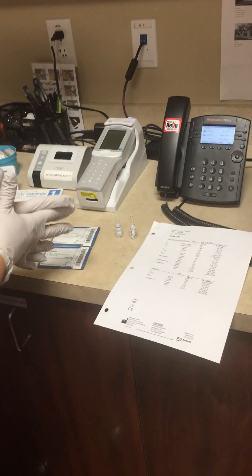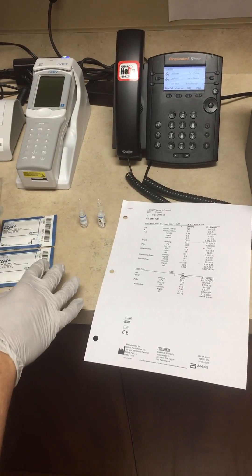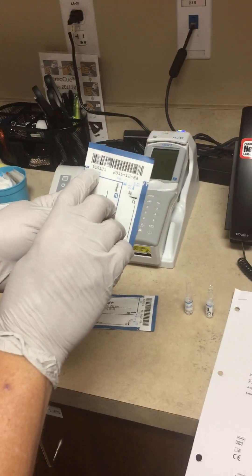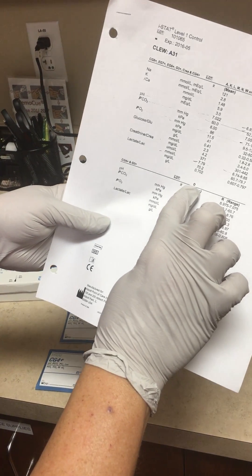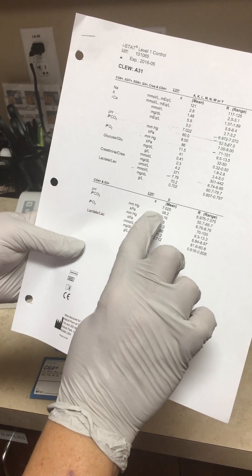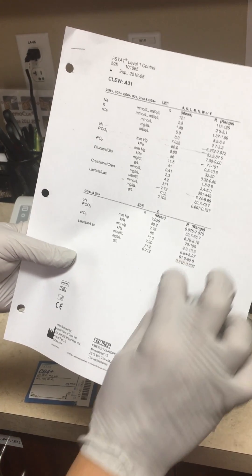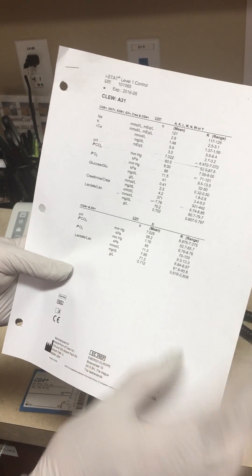We've got the correct lot number of the reference ranges for the controls that we're using. One thing to pay attention to is the lot number of your cartridge — it starts with a D, so you want to make sure that you use your control ranges that start with D as well. The pH range for D would be 6.975 to 7.075, and then the PCO2, PO2, and lactate follow.